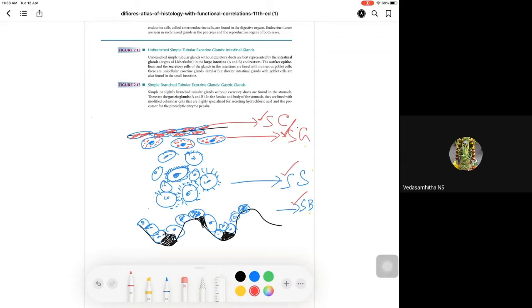There is a difference, isn't it? So there will be hyperkeratosis. So that is the keratinized layer. By looking at the amount of keratin, you can differentiate sole and palm from other structures in our body. Those are the two areas. And this is like nice basket weaving. This is known as basket weaving pattern, which we should not call hyperkeratosis, because these are normally hyperkeratinized areas. If you look at the palm, you can see it is different from the dorsal aspect of the hand. These are hyperkeratotic areas, which is a normal component. This is the understanding of the skin.